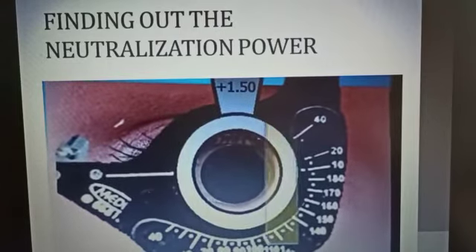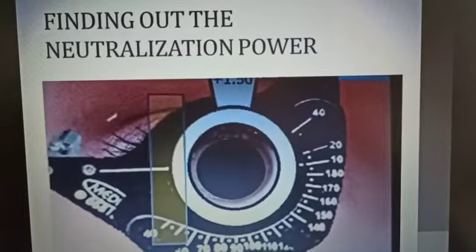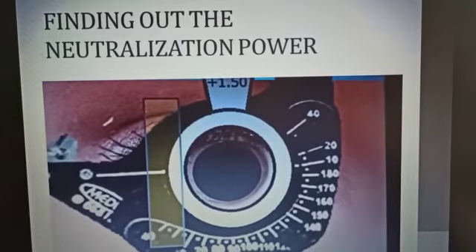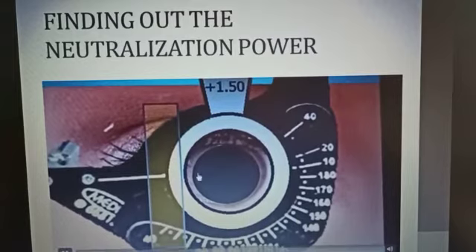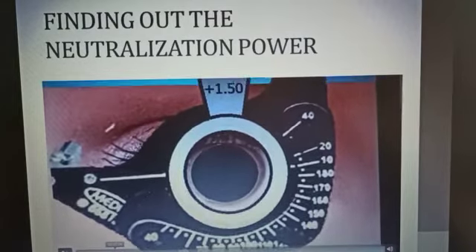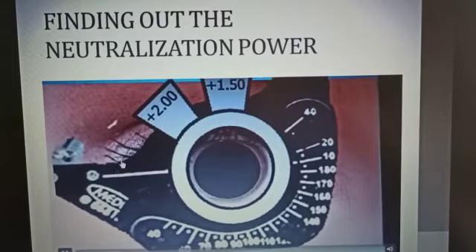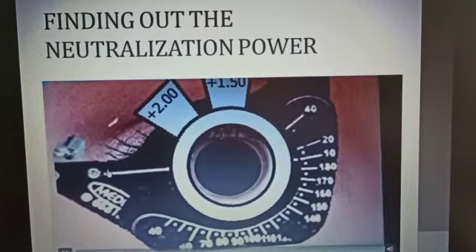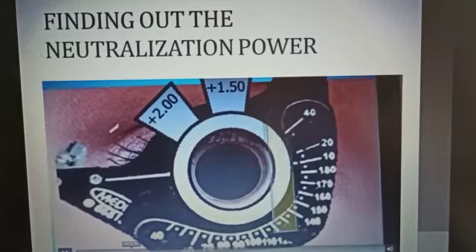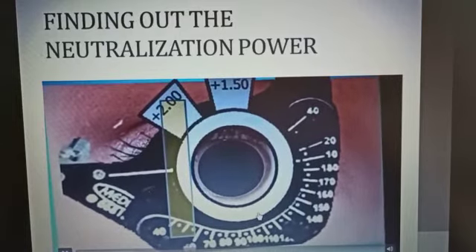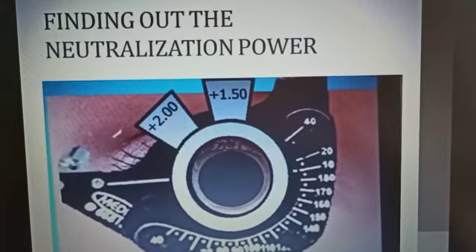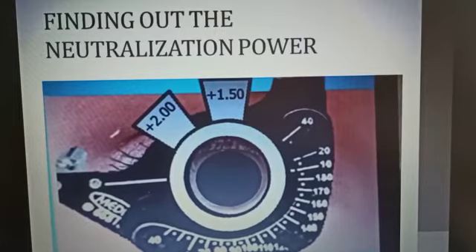Now we have to see the reflex. Here you can see the reflex is with movement. Now what we have to do is add plus spherical lenses — convex lenses. Here we have added plus 2 convex lenses. Now we have to check the reflex again. It is still with movement, but you can see the reflex inside is a bit wider than the previous one. It means that we are closer to our neutralization point, but the whole pupil is not yet filled, so we have to proceed with a higher power.